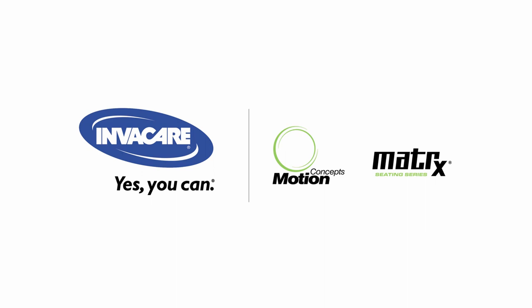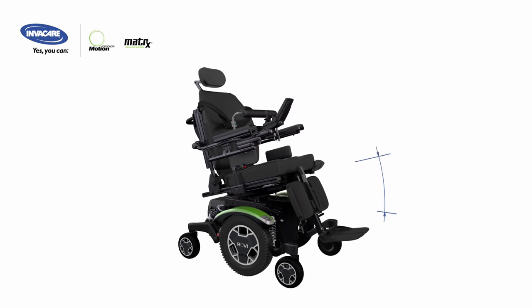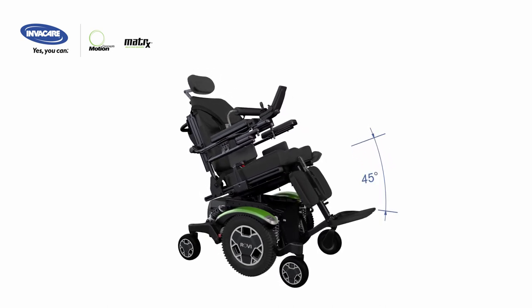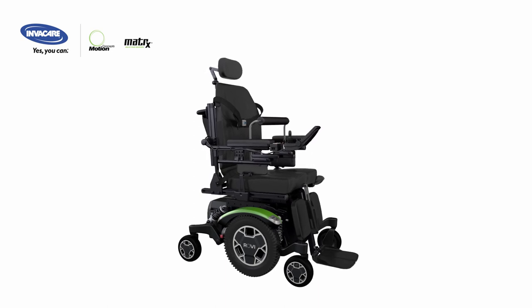The innovative Motion Concepts MPS Max Modular Power Standing System features 45 degrees of tilt, 173 degrees of recline with extended shear reduction, and up to 7 inches of elevation available.